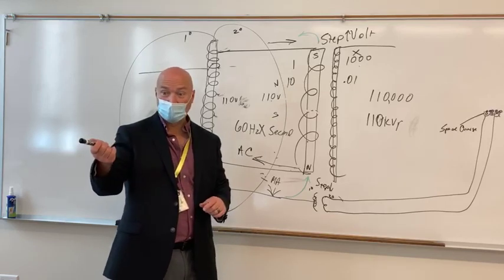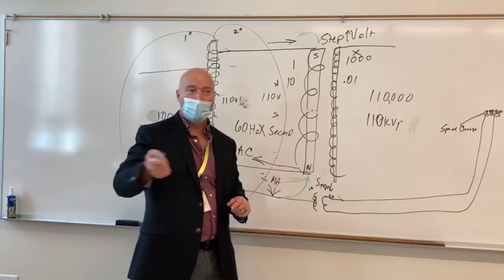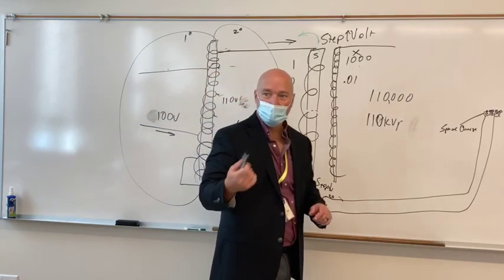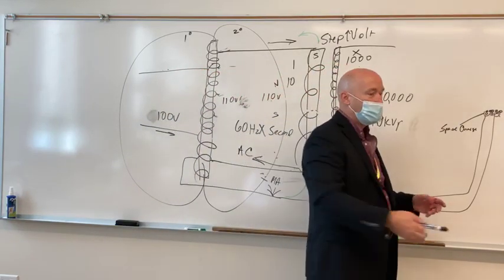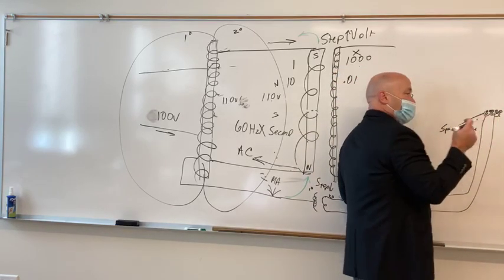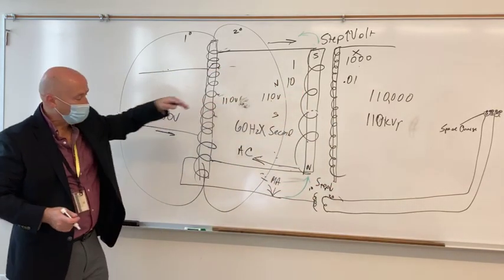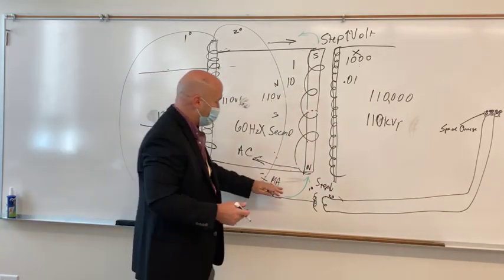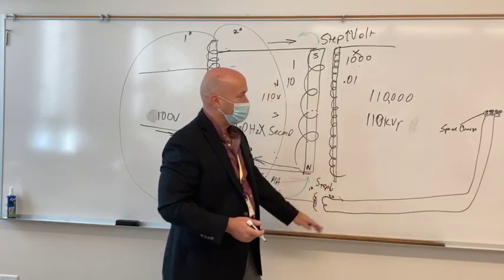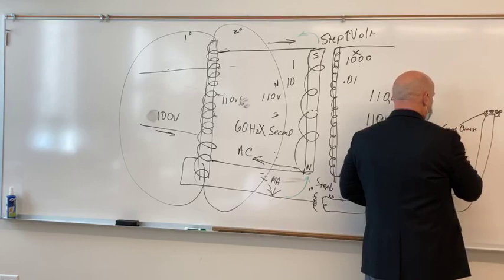Electrons, it's ions, so you're creeping up on it. Hot is heat: thermionic emissions. There we go. So when we press our prep button, this isn't doing anything yet in the prep stage. This is activated so that we select our mA, we step down our voltage, and we heat up our filament to create thermionic emissions.